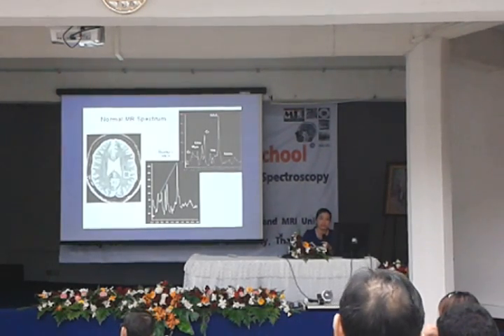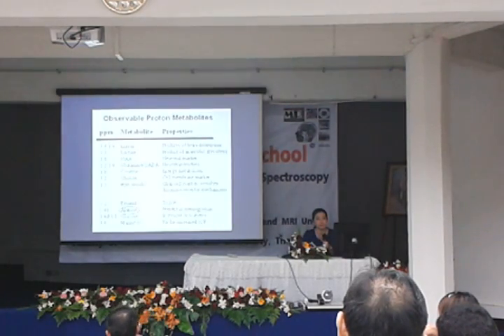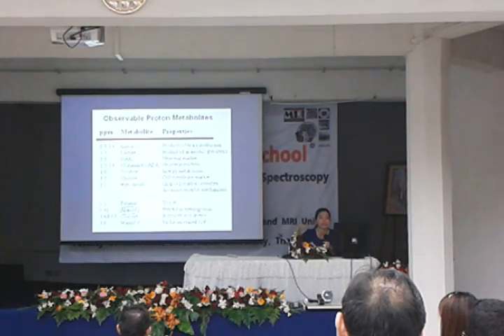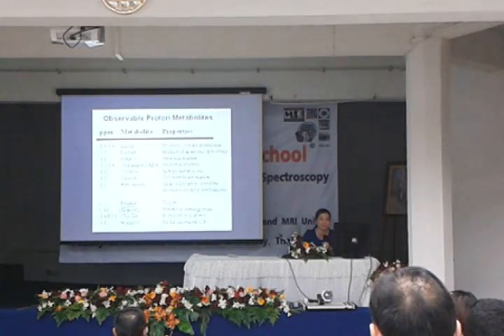For the radiologist, we will try to recognize the abnormal pattern. We have to remember where each metabolite is in the spectrum, and what kind of spectrum has meaning. For example, choline will go up in brain tumor or higher grade tumor.